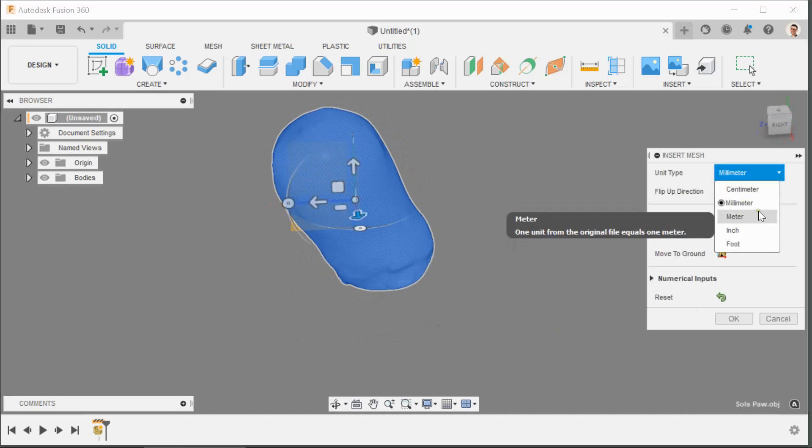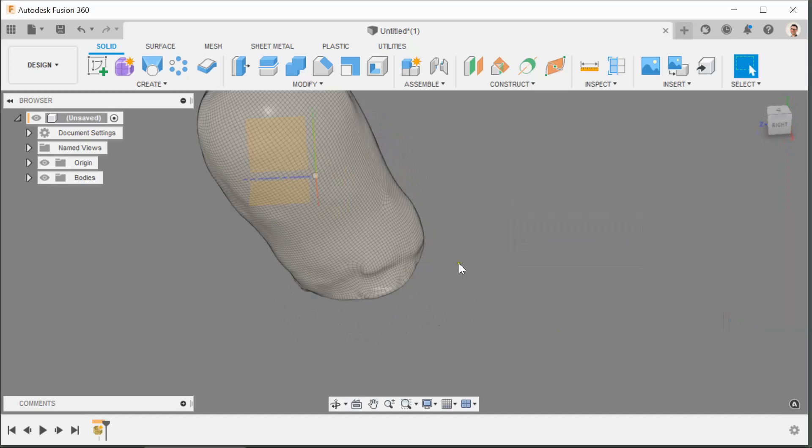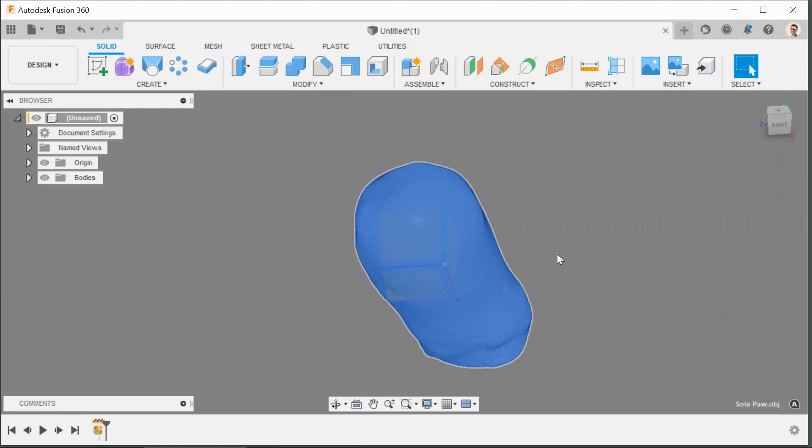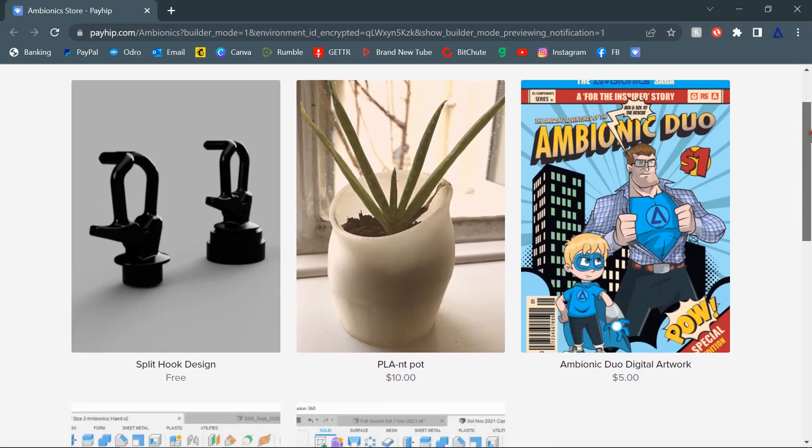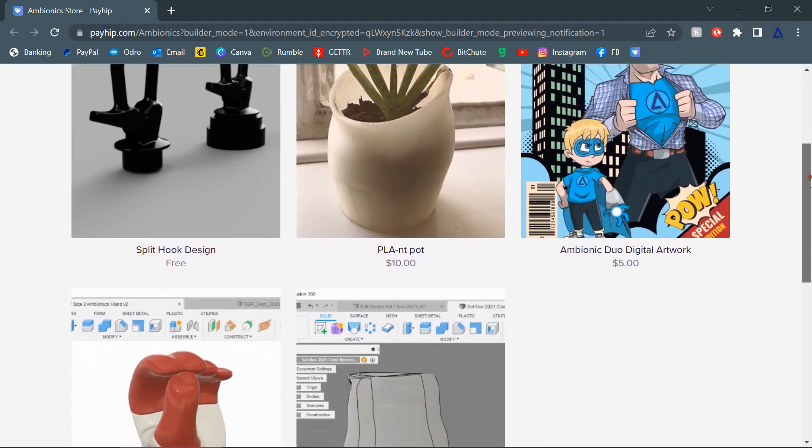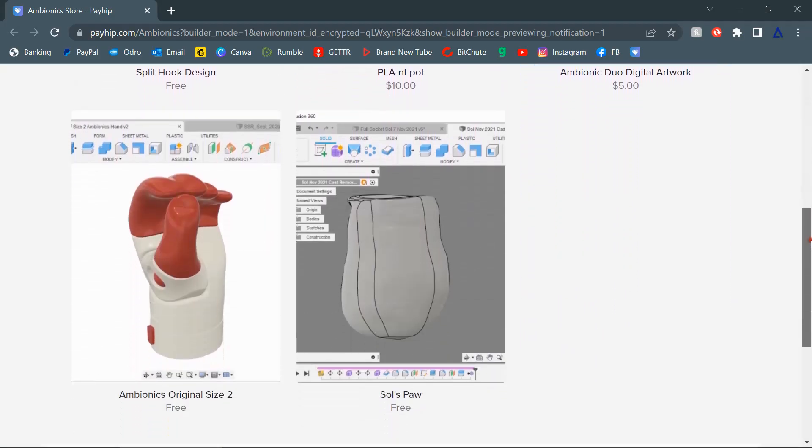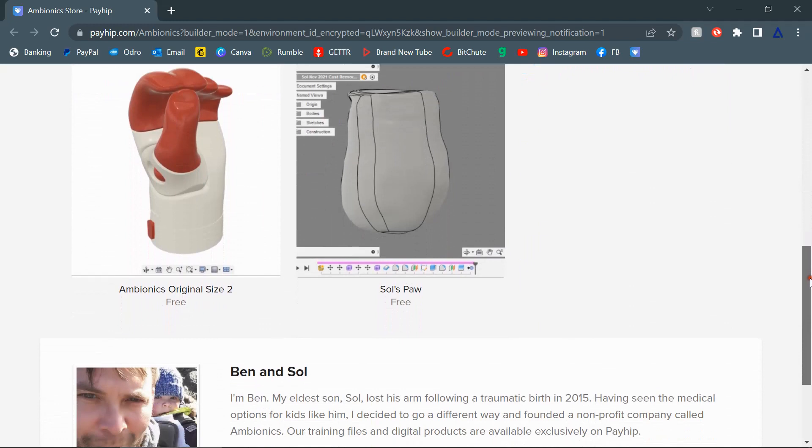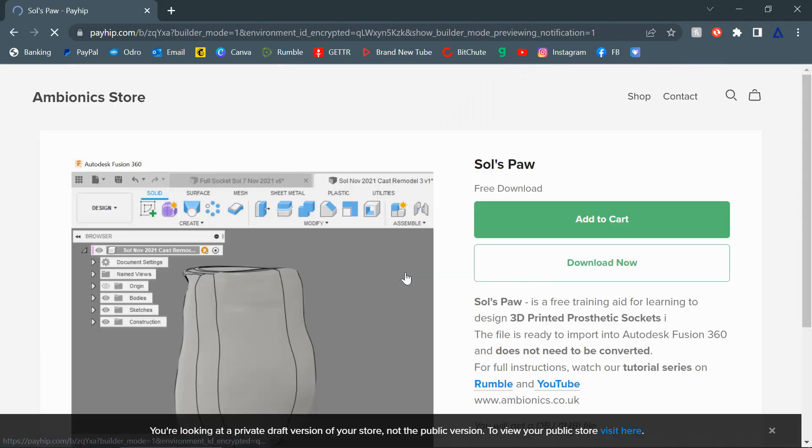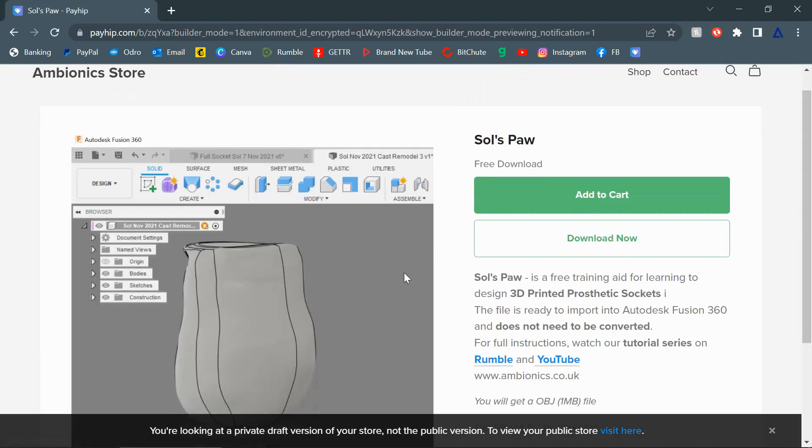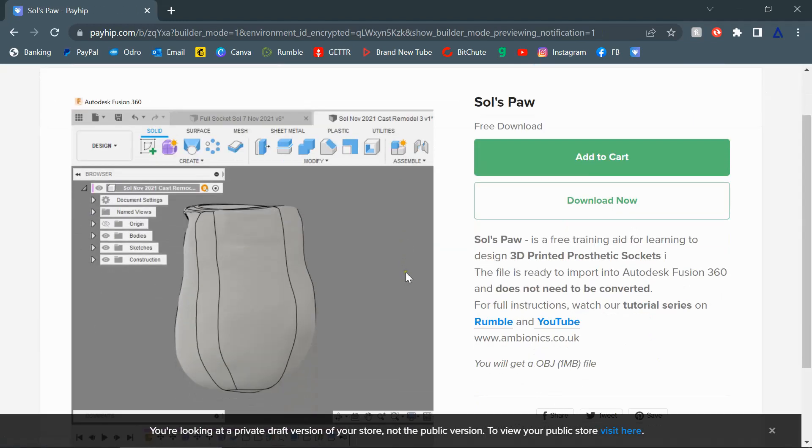This session is designed to work around a teaching aid which I'm providing for free, so a link should pop up. If you just click on that link it'll take you to our Payhip shop. Download the OBJ quad file there and bring it into Fusion 360 and you can go through the process with me side by side.